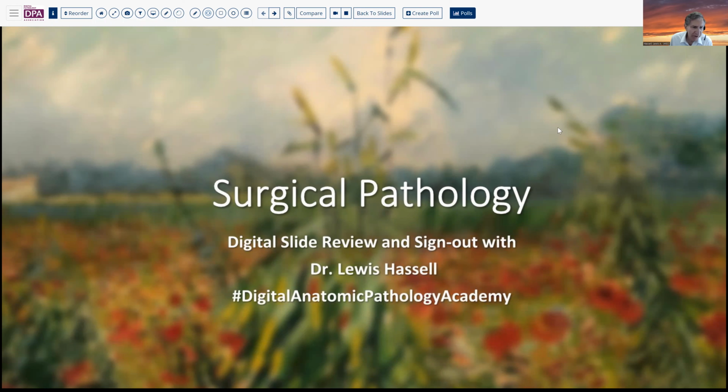Our program is the digital slide review and sign out portion of the Digital Anatomic Pathology Academy. We're happy to share cases that are included in the teaching materials from that site, which is a joint venture between Path Presenter, well known in many respects, and the Digital Pathology Association, eager to help the pathologists of the next generation become better trained and better prepared to handle the challenges that are ahead.